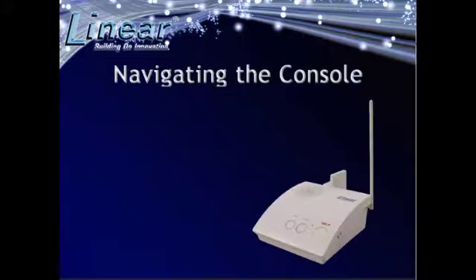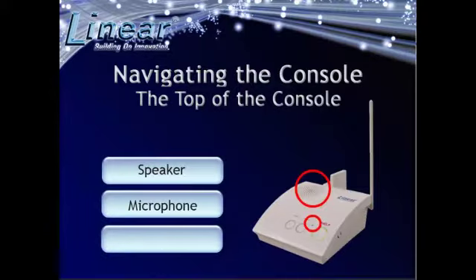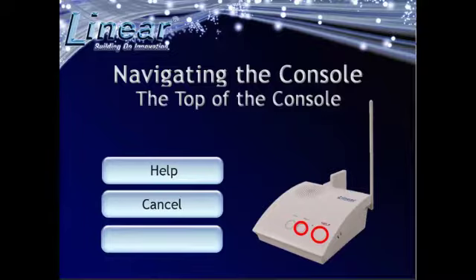Navigating the PERS-4200 involves familiarity with the features on the top, bottom, and rear of the console. On the top of the console, you will find the speaker, microphone, antenna, help, cancel, and home buttons.